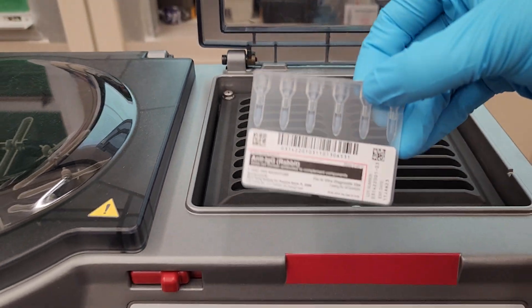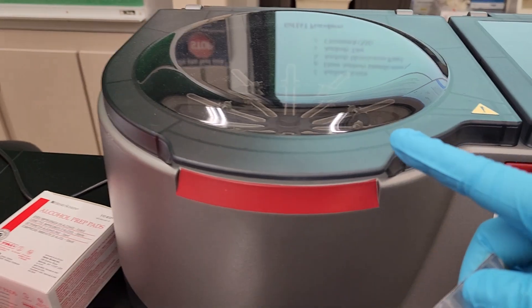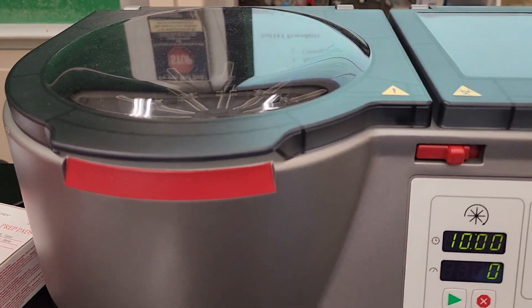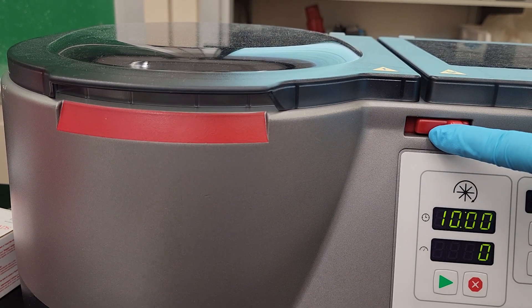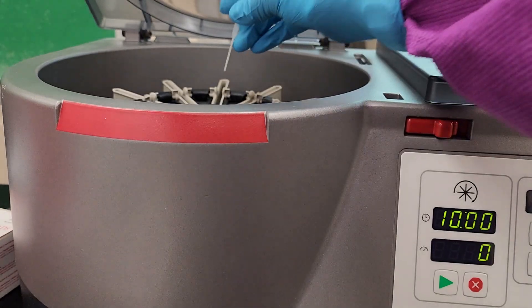We'll take that out — and there's my gel card. You close it nice and gently. And then in order to open this guy up, you'll see it locks. You're going to need to flip this toggle to the right and then open up the lid. You'll put your gel card in.